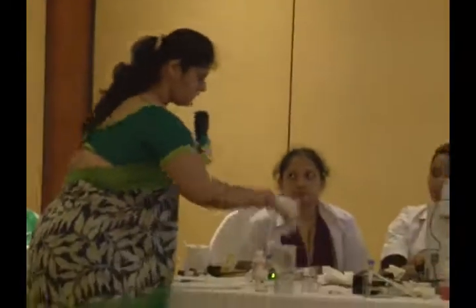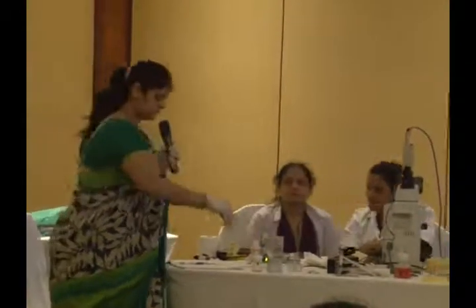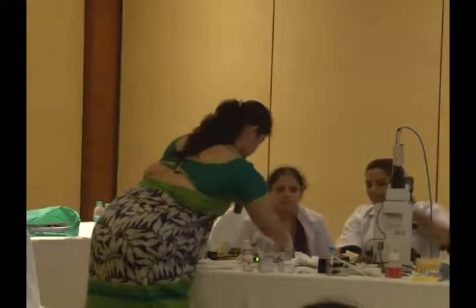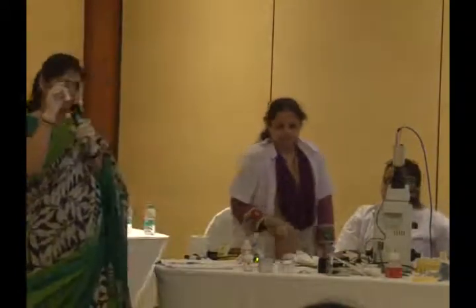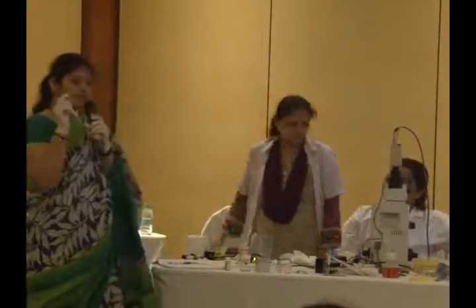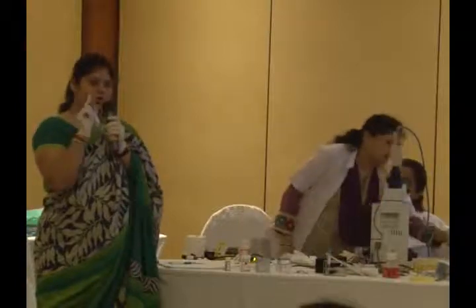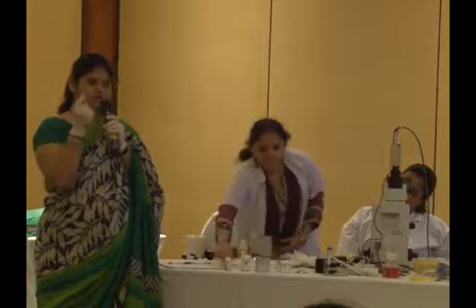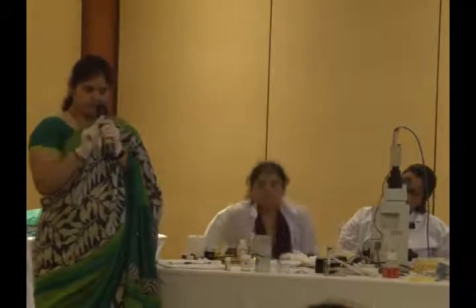We need a conical bottom tube, different density gradient media. I have 55 and 80 right now, lower and higher, and sperm wash. Three things are required for the density gradient. First, you prepare the gradient tube in which you take higher density, lower density, and then the medium will come above it. But here I will do the reverse. First, I will take the lower density. Then I go underneath and load the higher density, so we have a better interface.